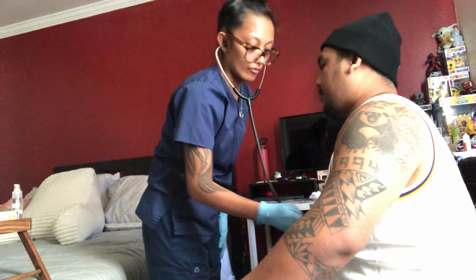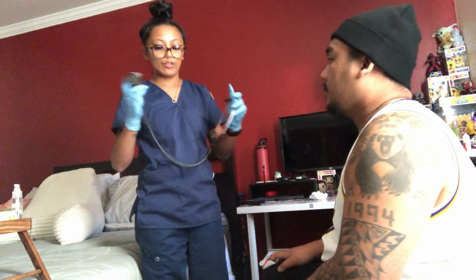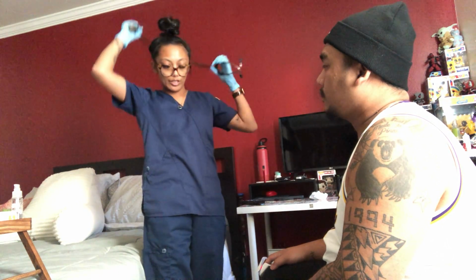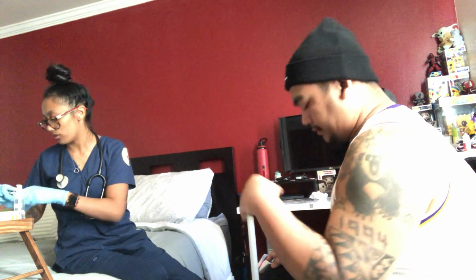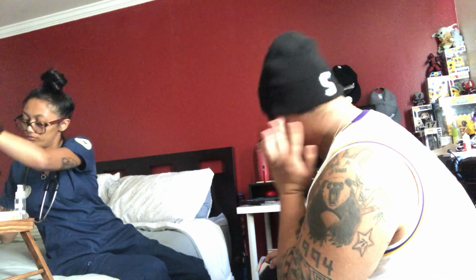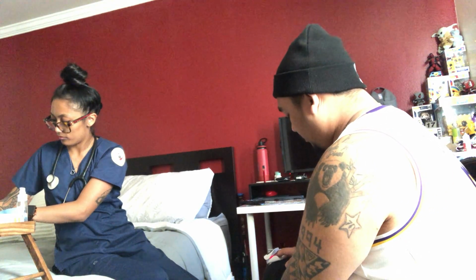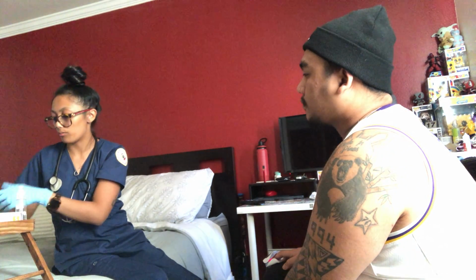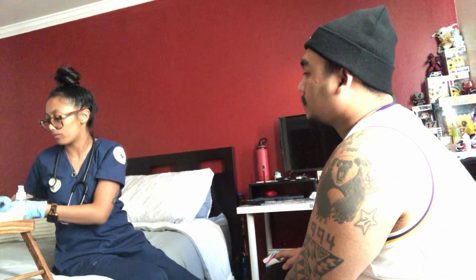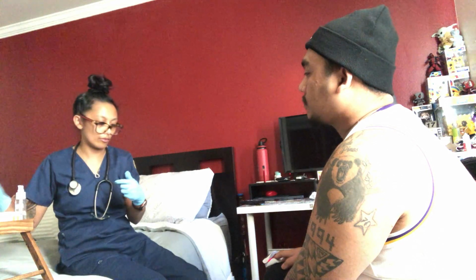Okay. So your airways have cleared up, which means that the medication is working. I heard clear breath noises, which is awesome. I'm going to make a note of that. And then can I have you cough for me? Okay, still the same, dry, non-productive. Still no sputum. Okay, I'm going to take your pulse and your respiratory reading.